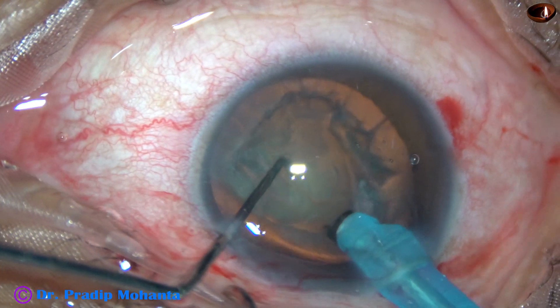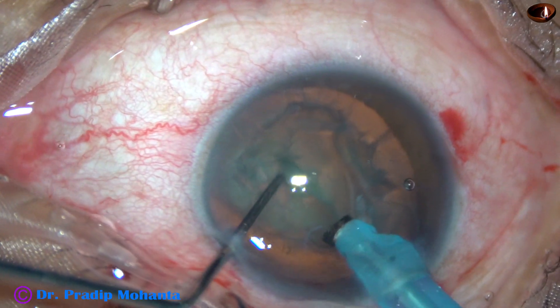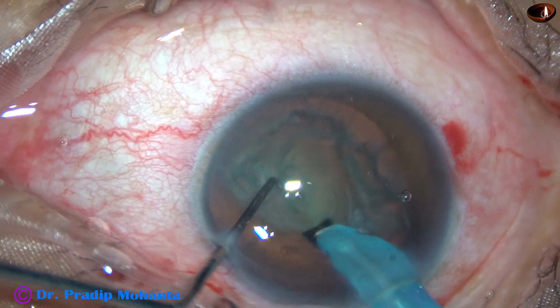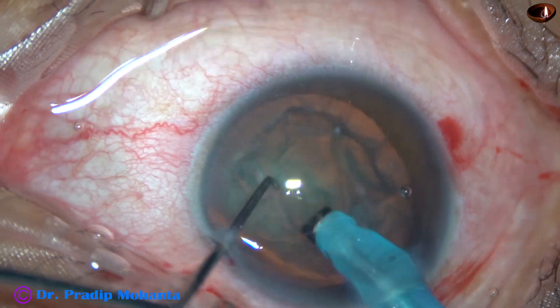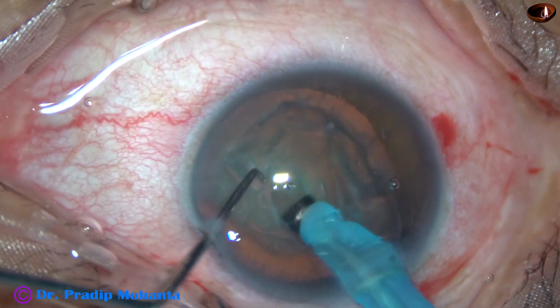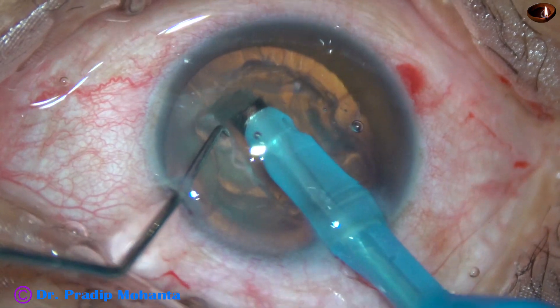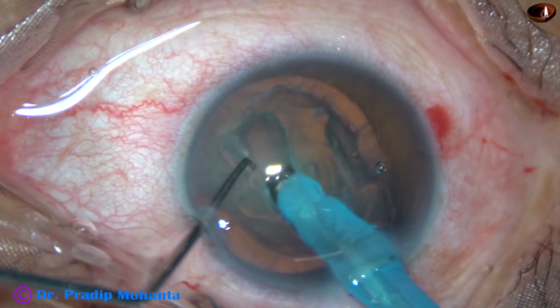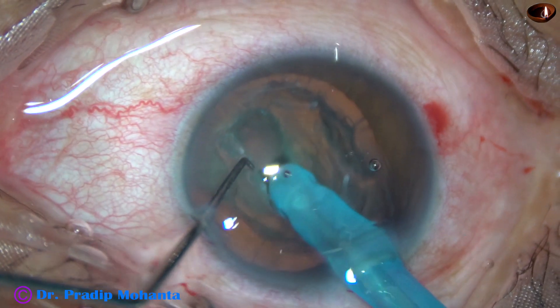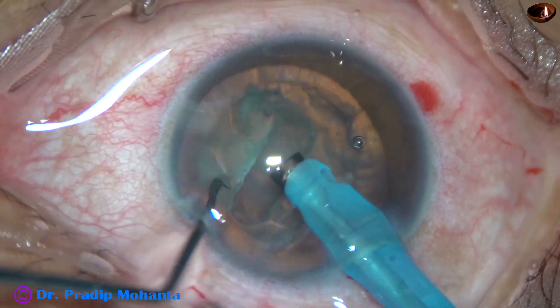However, I tried if I can do mechanical chop, but then I found that stop and chop will probably be better. So I started making a trench, and at the central part I made the trench deeper.